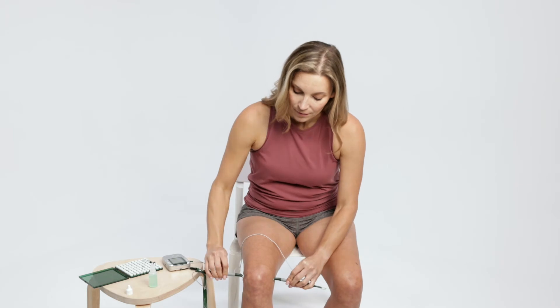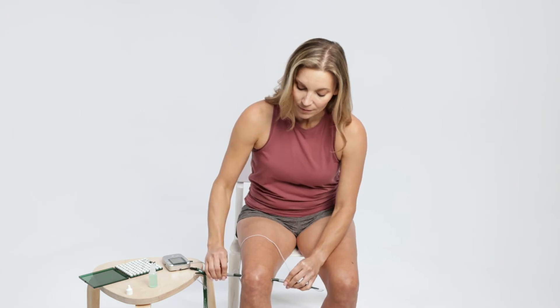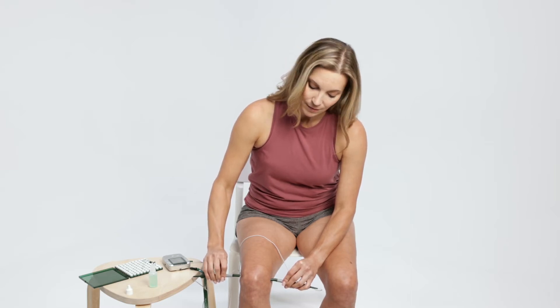Press smart probes on clean, dry skin. The timer cycle will start with two beeps when the skin is contacted and end with a single beep. Hold probes firmly against skin for the entire 10-second cycle before moving to the next treatment location.